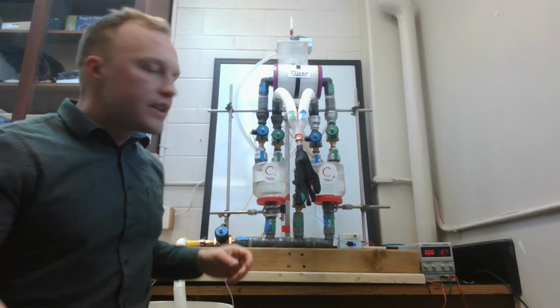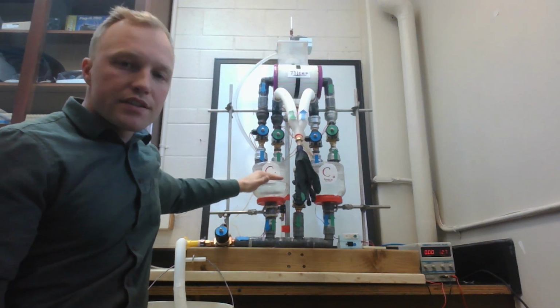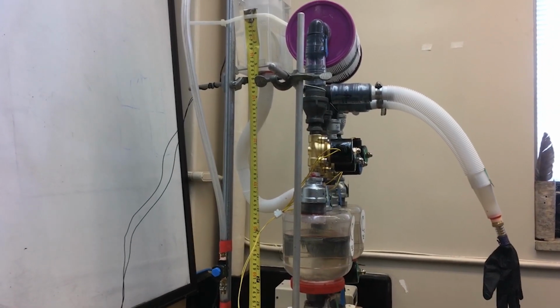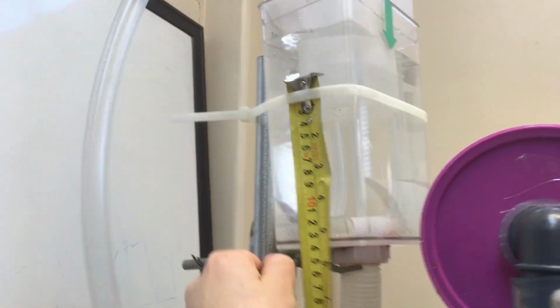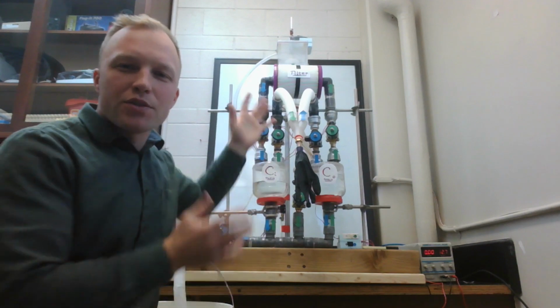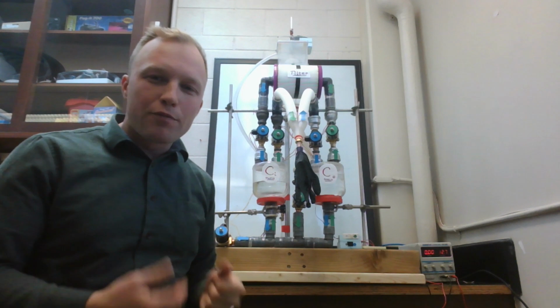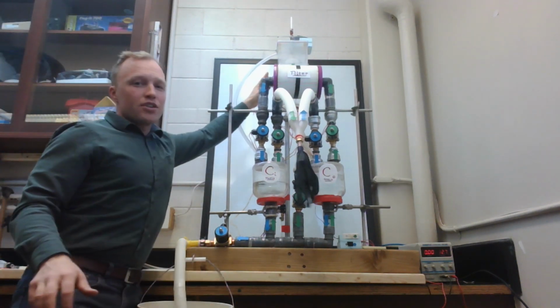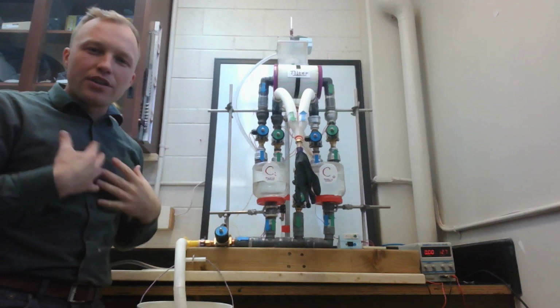The pressure that is provided by the height of water of that cistern above this cylinder is the pressure of ventilation. You see, ventilation requires a certain amount of pressure to inflate the lungs, and that pressure happens to be about 40 to 50 centimeters of water. That's a measure of pressure that has to do with the height of a column of water above a surface. So simply by making this thing out of water, that is a natural kind of way of providing that pressure. And this cistern can be moved up and down on a rail behind here to change the pressure provided to the lungs.